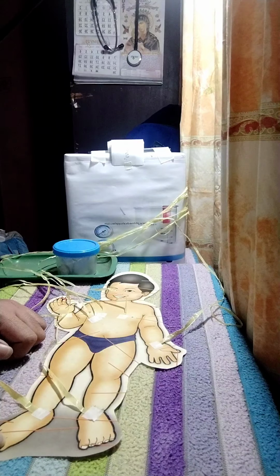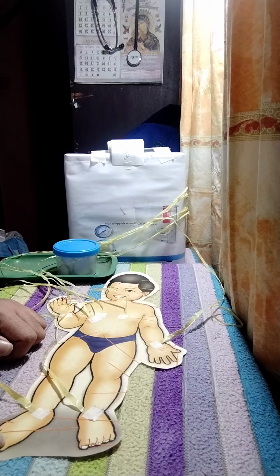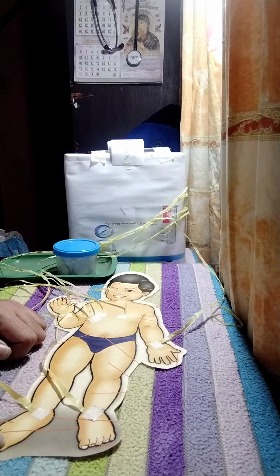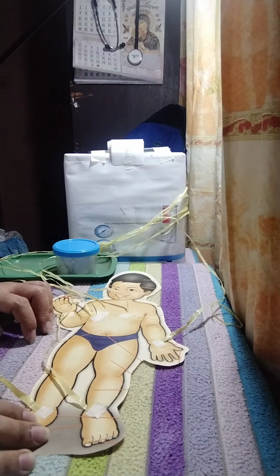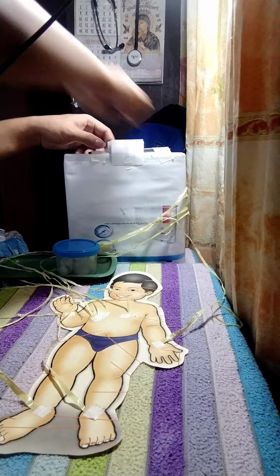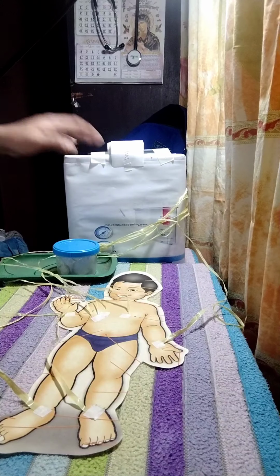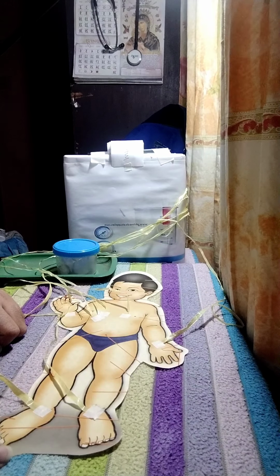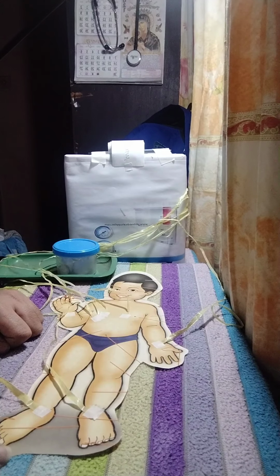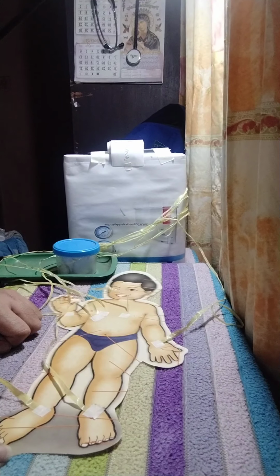Next, connect the precordial lead wires to the electrodes. Make sure that the metal parts of the electrodes are clean and bright. And then after the application of each lead, make sure that the paper speed selector is set. The machine is set to full voltage. Next, if necessary, enter the appropriate patient identification data into the machine.